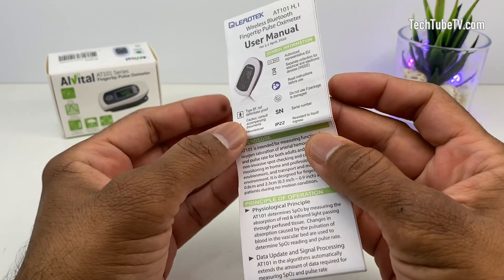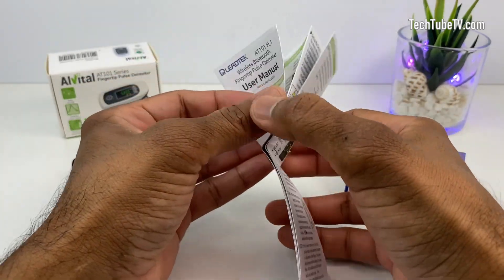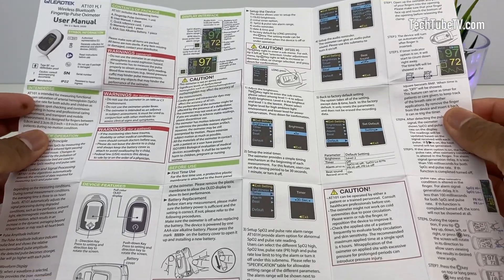This is the pulse oximeter user manual. It has quite a lot of details, but I wish that it was made in the form of a booklet with larger fonts. Although I can read them, it is not very comfortable due to the small font sizes.